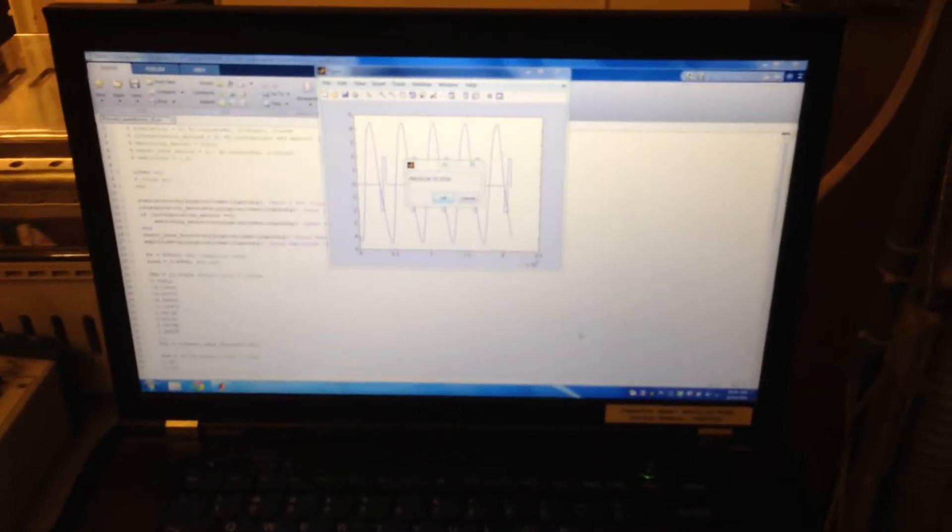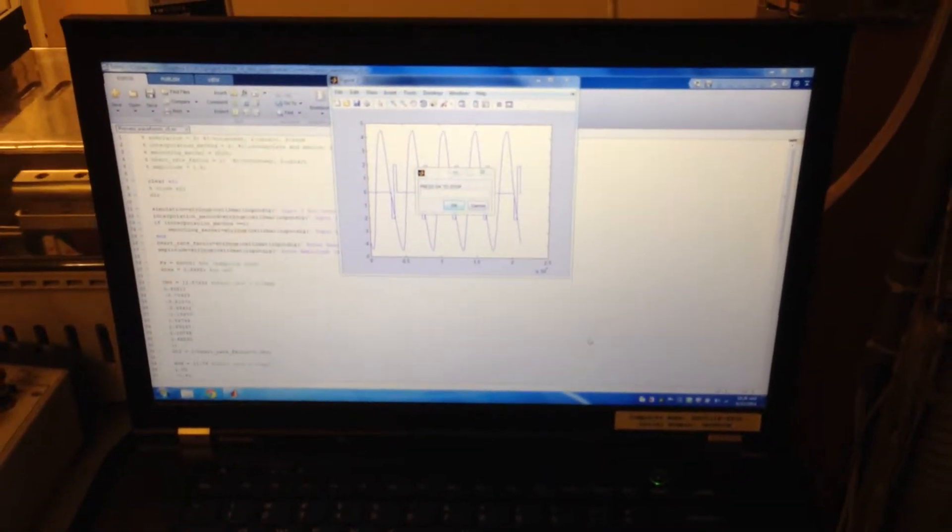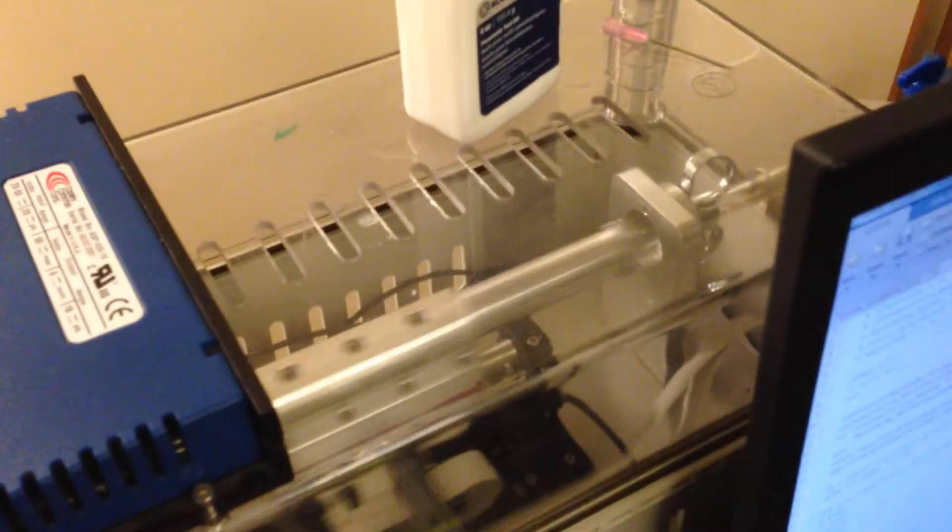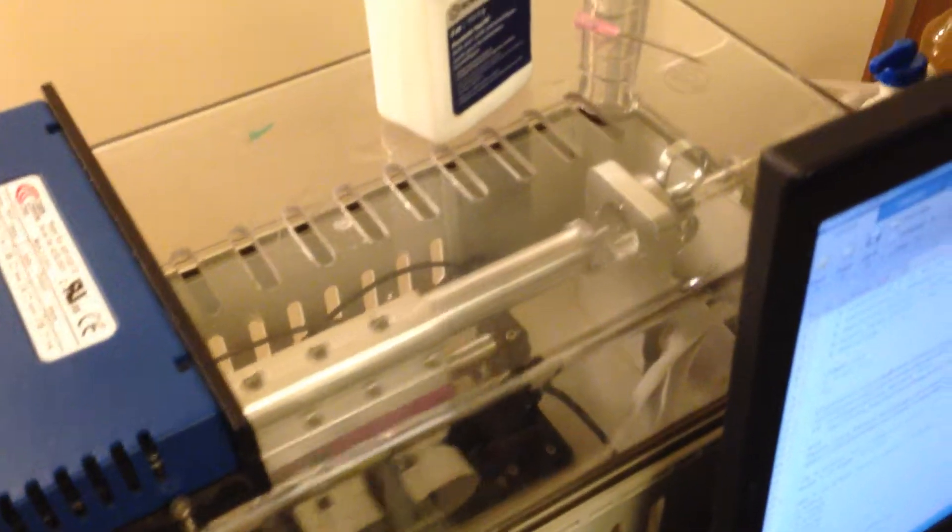It puts in a flow waveform that is cerebral spinal fluid pulse, that's measured in a patient with Chiari malformation, you can see here. And then this pump moves according to the waveform.